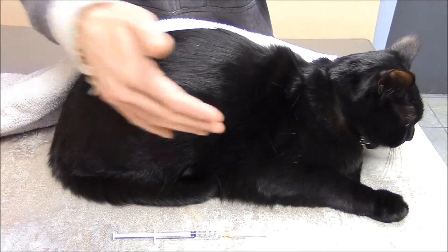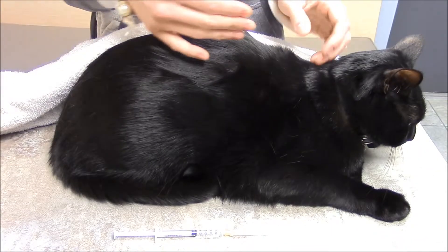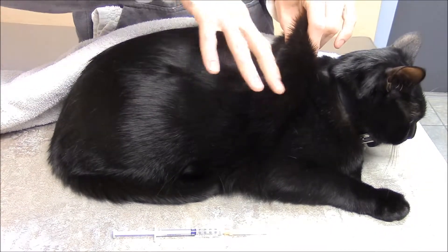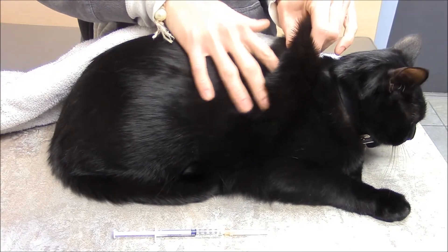When you go ahead and give the injection, make sure to go parallel to the cat's body. You want to go straight into the skin. You don't want to go down into the skin — you can hit muscle or bone, and that would be bad.